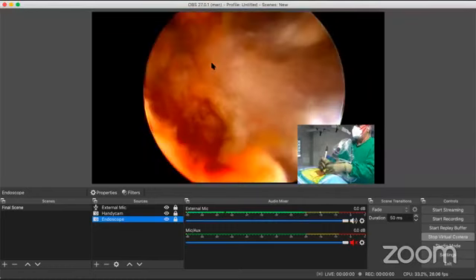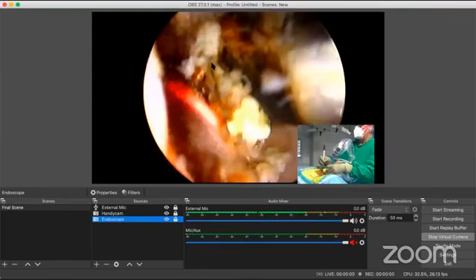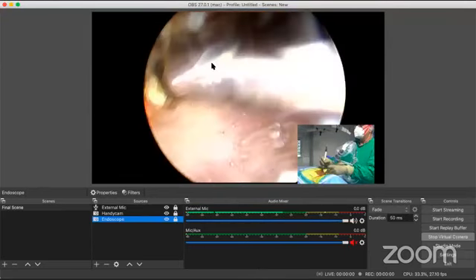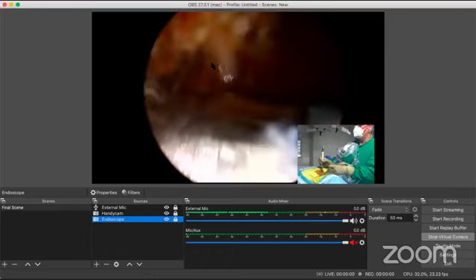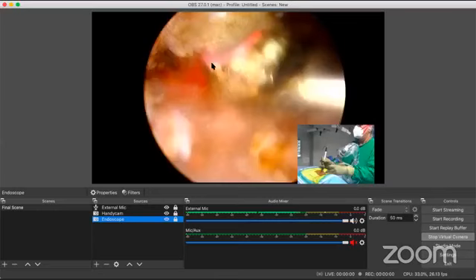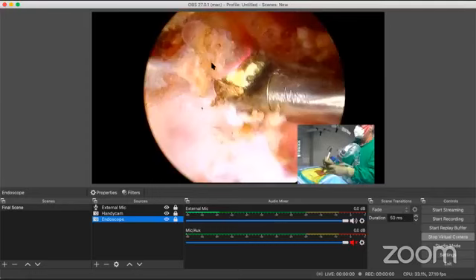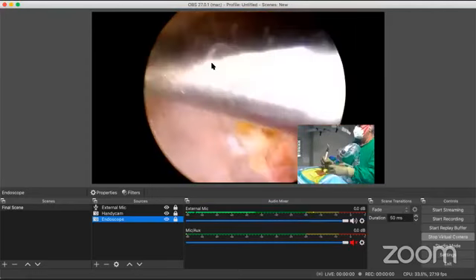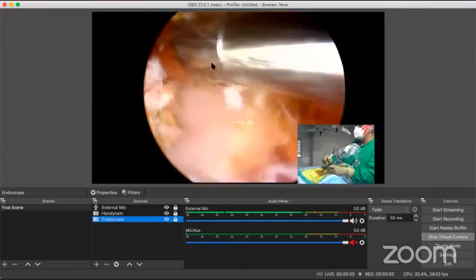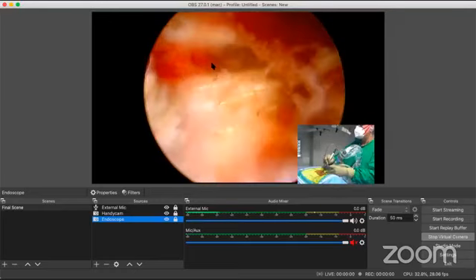So we are going to go slowly and I'm going to correct myself. I'm going to try and become more and more vertical with my scopic view and at the same time push away tissue so that I can localize on the spinolaminar junction. And we can have some more better vision here. See, slowly everything will come in our view. We are creating a bed space by stripping away the tissues. Followed?